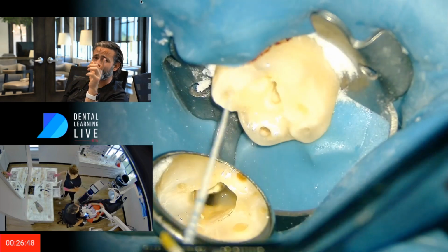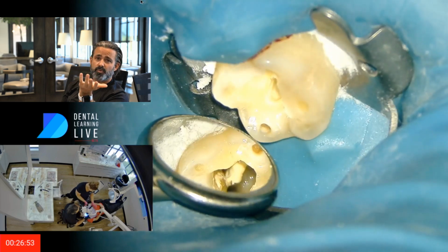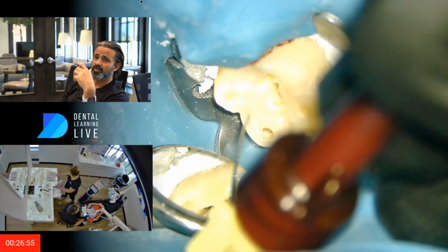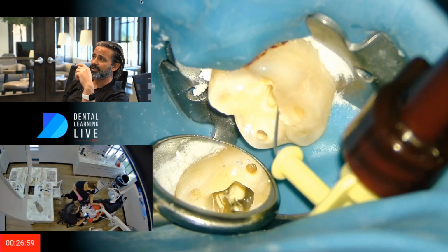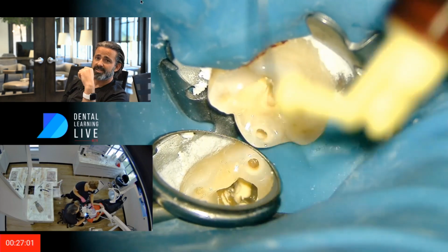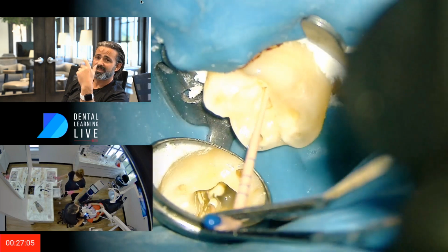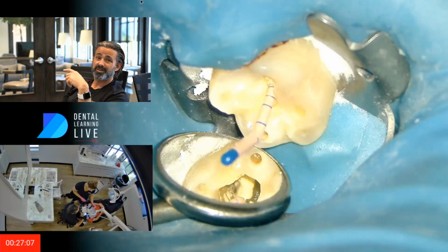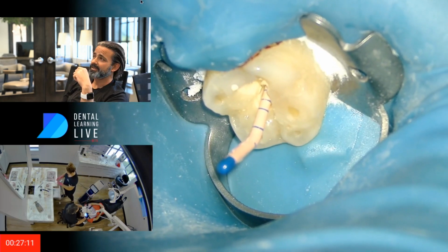So a lot of times you'll see sealer flow up into the other canal as well. If you inject in one canal, it follows up the other. And that was the case in this one as well. So now I'm injecting sealer into the mesial buccal canal, I'm going to place the master cone. I stuck with 30s. I liked the way they looked on the X-ray. Mind you, I was using size 20 paper points.